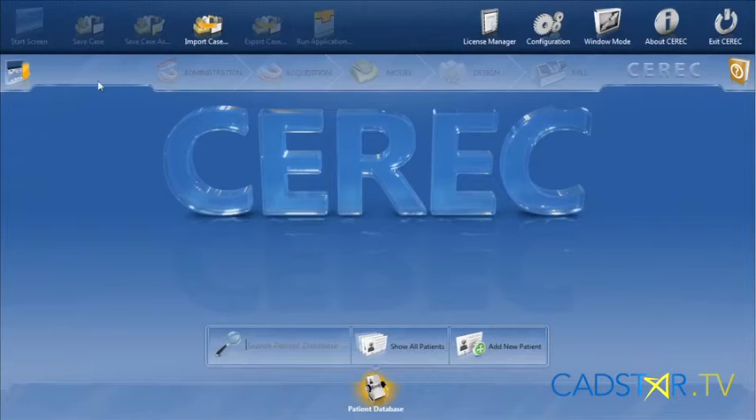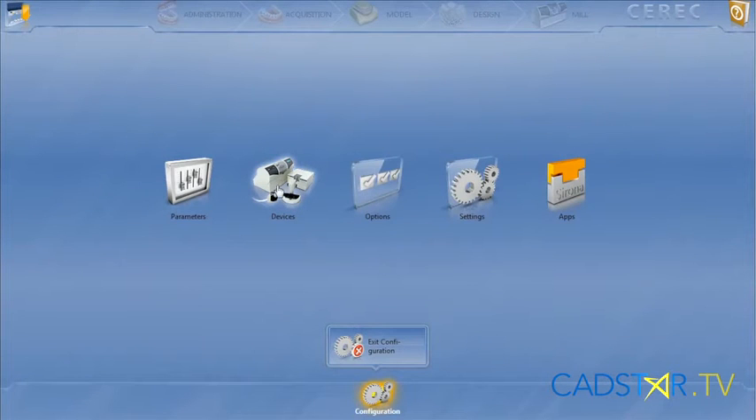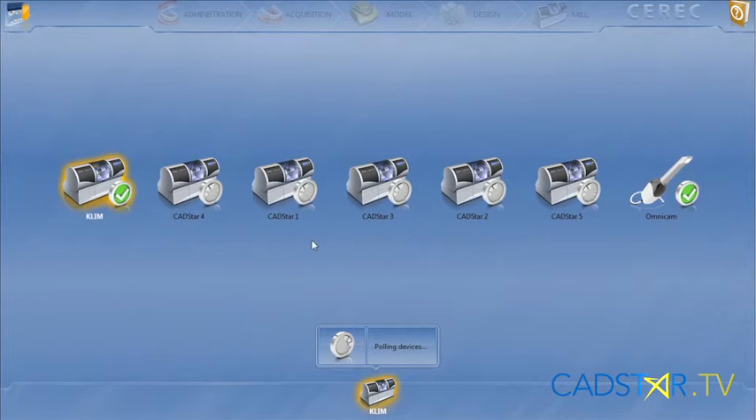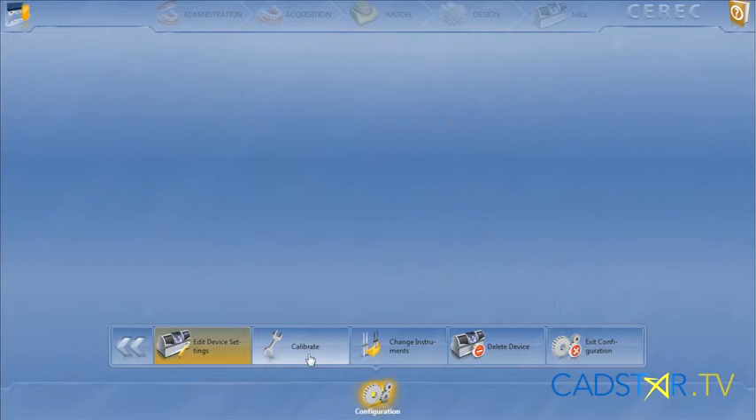For calibrating your milling unit, you'll bring down the step menu, go to Configuration, select Devices, select the milling unit you need to calibrate, then hit Calibrate on the bottom.